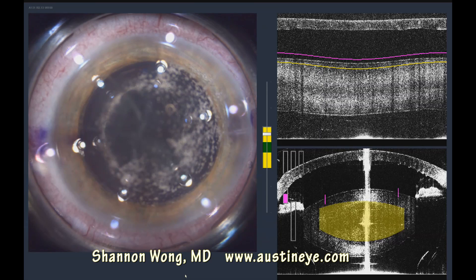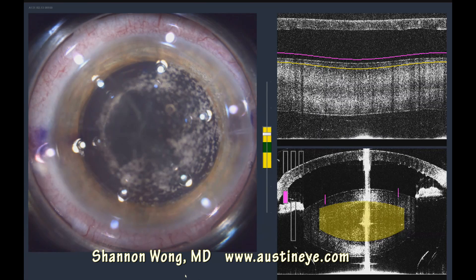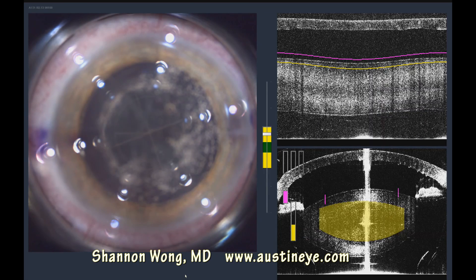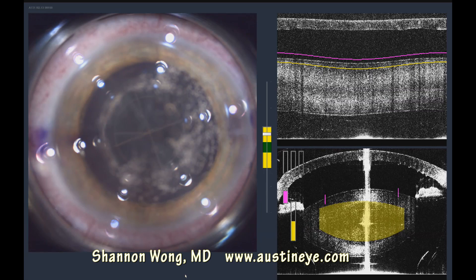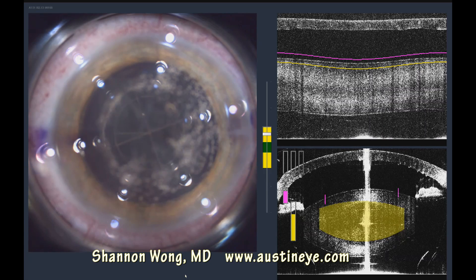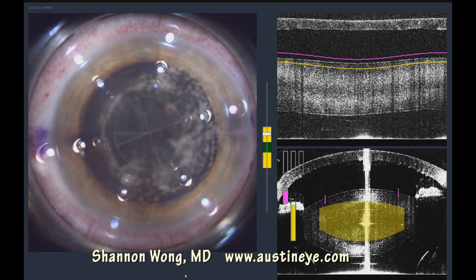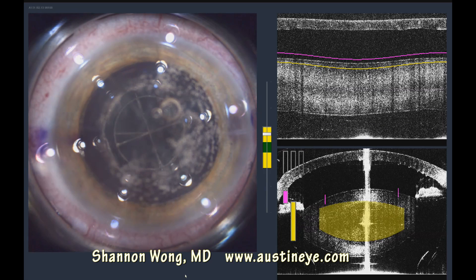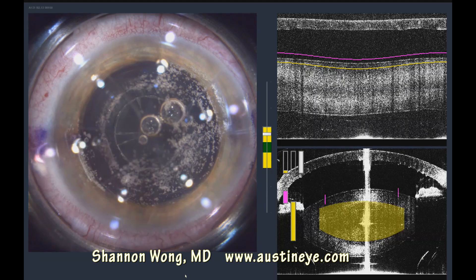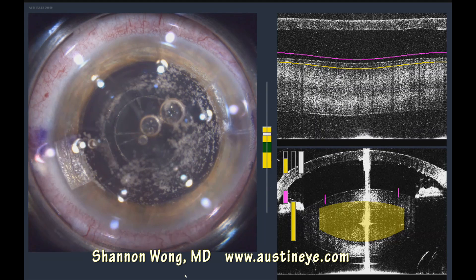On the lower right screen, the purple bar indicates the progress of the capsulotomy. It starts below the anterior capsule and moves upward. We're creating a chop pattern and a cylinder pattern — the cylinder pattern is 4 millimeters in diameter and the chop pattern extends about 5.5 to 6 millimeters in diameter. The progress of the chop pattern is shown by the yellow bar in the lower right corner.